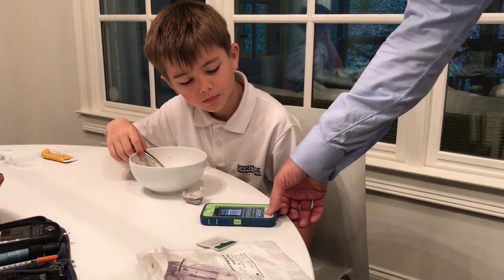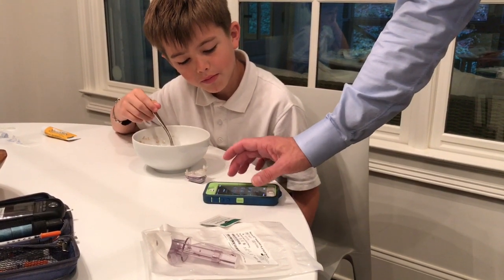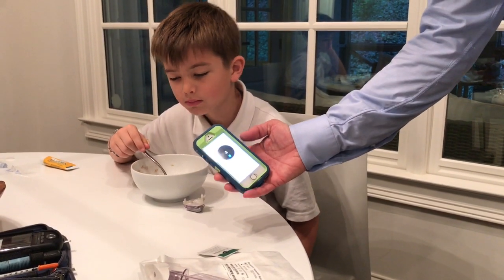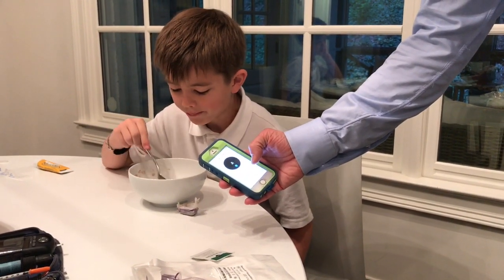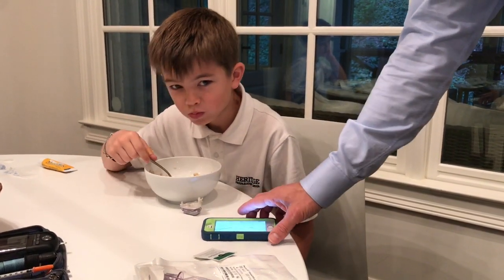To change the Dexcom we're going to need a new sensor, an alcohol wipe, and the phone or transmitter that's paired to it. You can see on this one we've got all question marks. When we looked at the data you can see it's really spotty and inaccurate, so it's time to change — and it's been more than seven days.